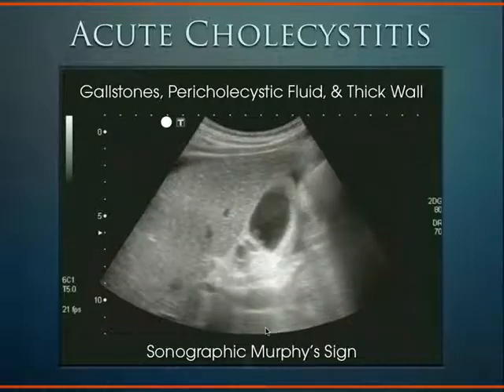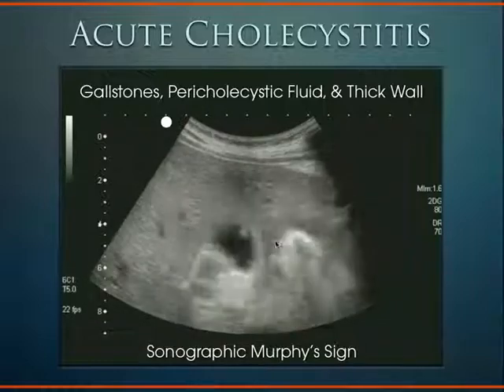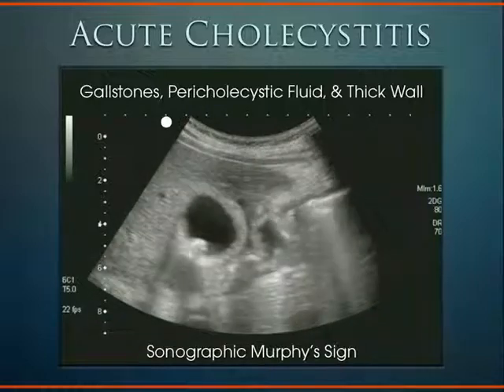That is what's called a positive sonographic Murphy sign. It's very specific for having cholecystitis.